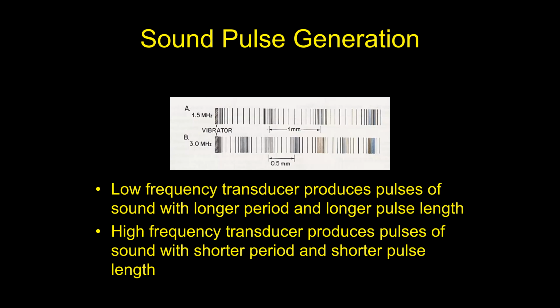Well, the ultrasound probe does the same thing. It's basically a speaker that's moving in and out physically, and it creates these compressional waves, which you can see diagrammed here, that propagate into the soft tissues of the animal. So basically, through water.